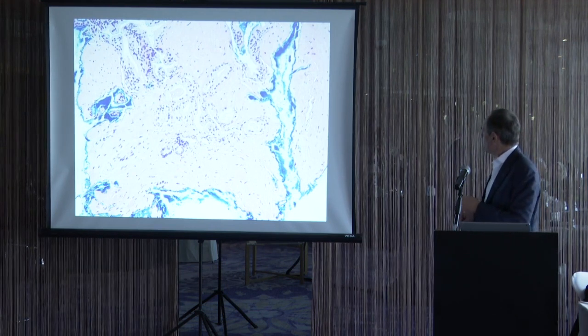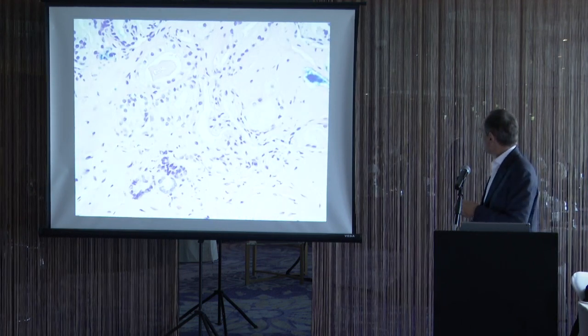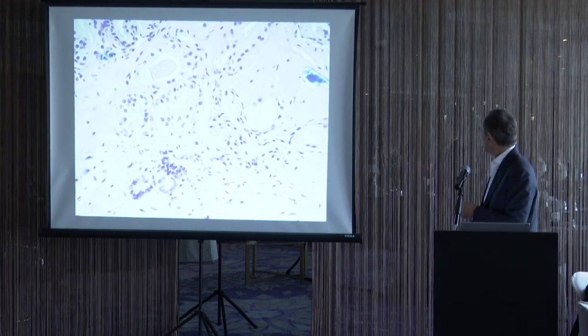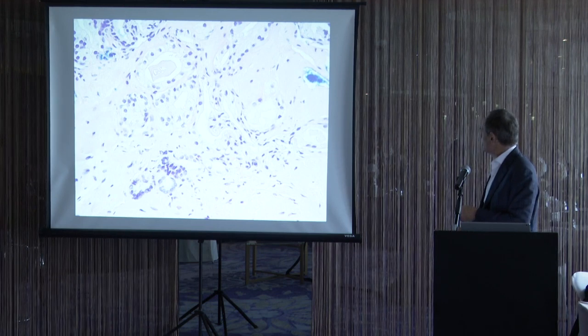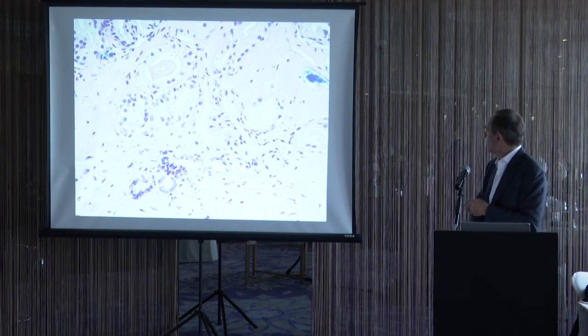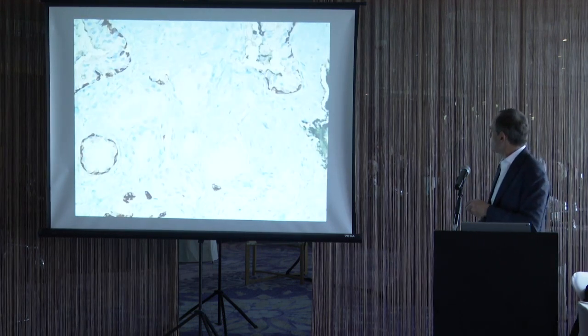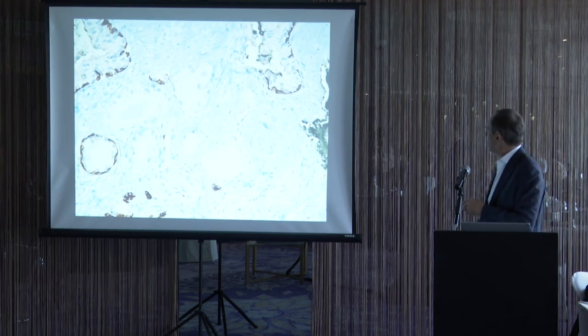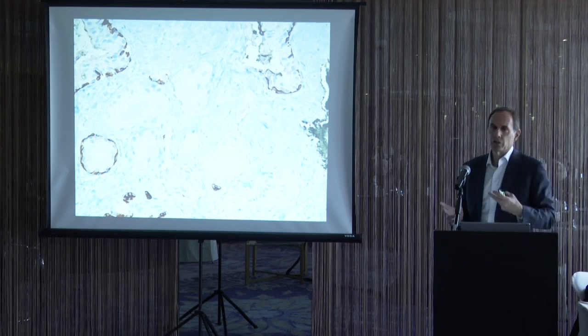But here we see this focus of crowded glands. And when you go to higher power, again, classic partial atrophy, scant cytoplasm at the surface, a lot of cytoplasm laterally, little ruffling to the luminal border. And you can see it's kind of merging in this case with some partial atrophy. Here we also see corpora amylacea, which favors benign. And again, one basal cell here, a couple basal cells, another. Very patchy, but many glands negative. All the glands that are negative are the same as the glands that are patchy. The whole lesion is benign.